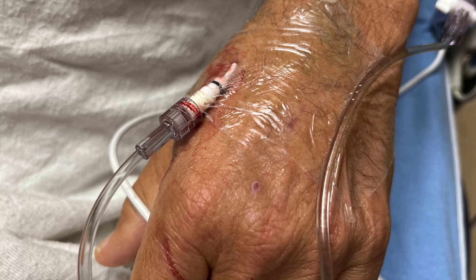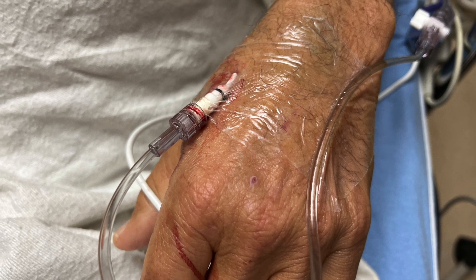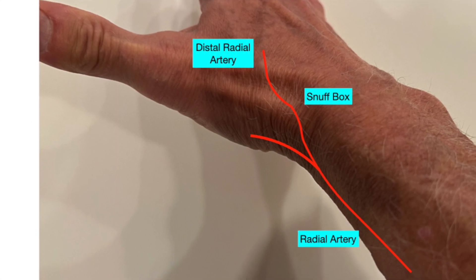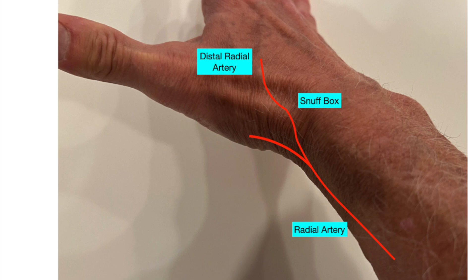We're going to talk about how to cannulate a distal radial artery. This is a really nice technique to use for A-lines in the emergency department. The distal radial artery is actually a branch that comes off the radial artery — it kind of runs across the snuff box there.